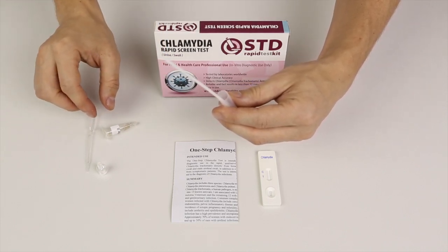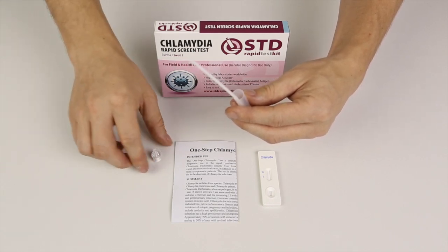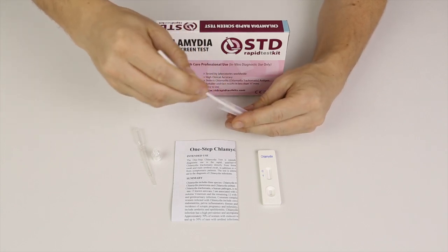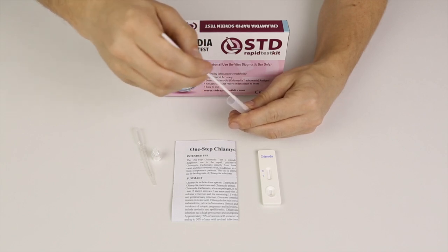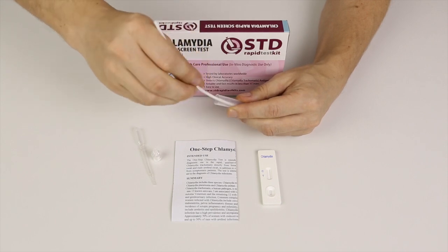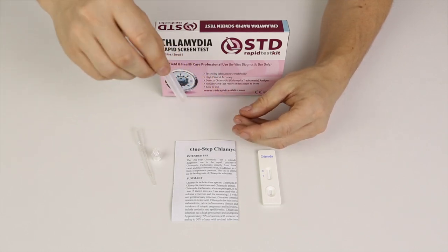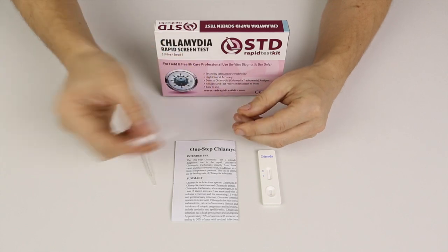Looking good so far. Now we're done with both buffer A and buffer B, so I'll remove those two. I'll let these liquids mix up. When you remove the swab after mixing the liquids for a while, try to squeeze the swab towards the wall of the extraction tube so that as much liquid as possible comes down like this.